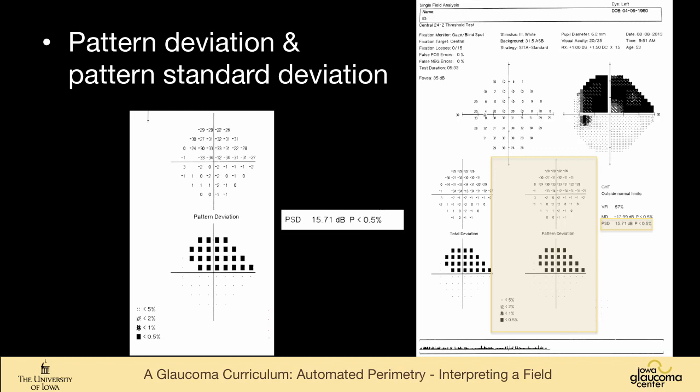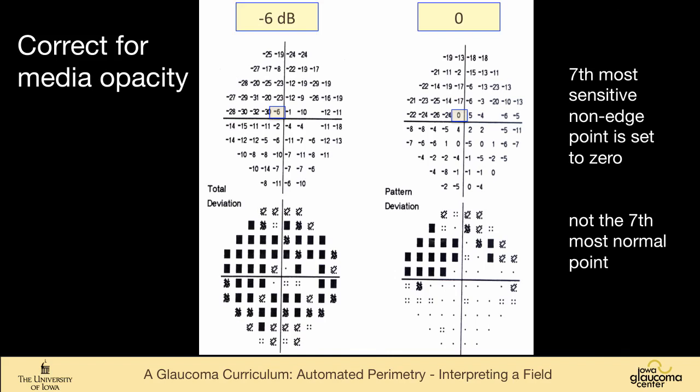A really important part of the field to get used to looking at is the pattern deviation. So pattern deviation is a measure of focal loss. It determines whether points are significantly depressed compared to their neighboring points. So you can see these points are considered to be significantly depressed in pattern deviation, and then the sum total of that is considered the pattern standard deviation. So that's a measure of focal loss.